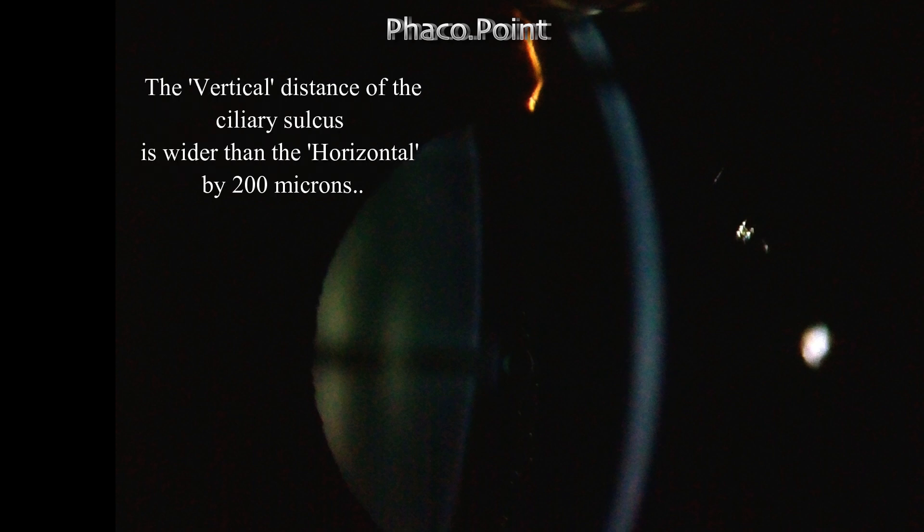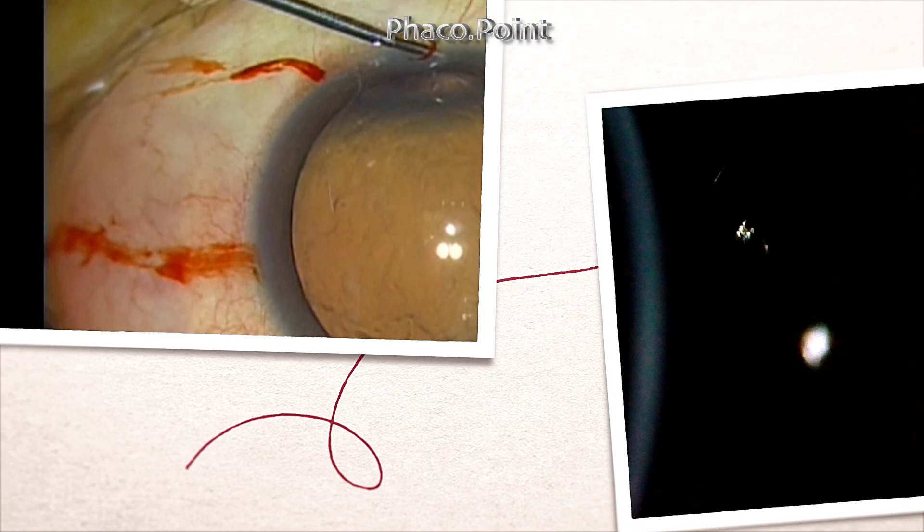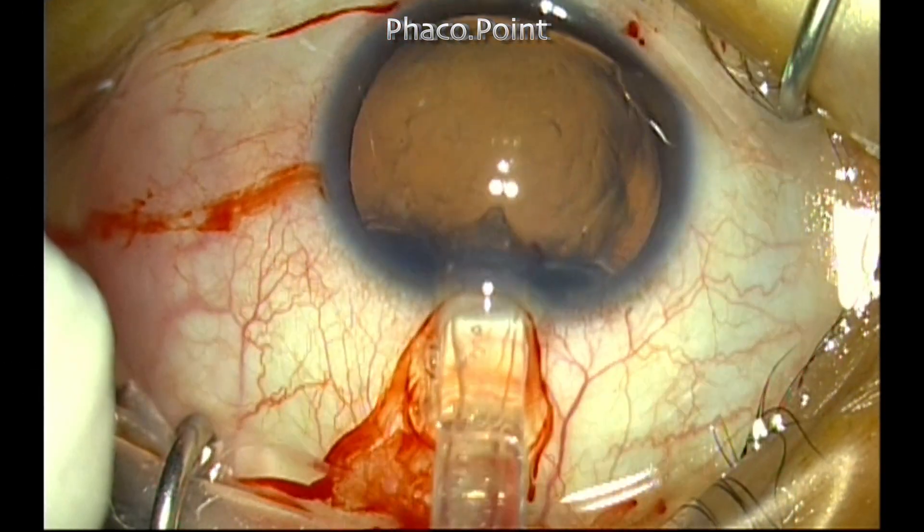If you perform a UBM, you can resolve the issue because it will tell us the true width of the ciliary sulcus. However, here's a simple solution if you don't have access to a UBM: implant the ICL vertically instead of horizontally, provided it's not a toric ICL. The vertical distance of the ciliary sulcus is wider than the horizontal by 200 microns, and therefore this helps to adjust the vault a little bit.